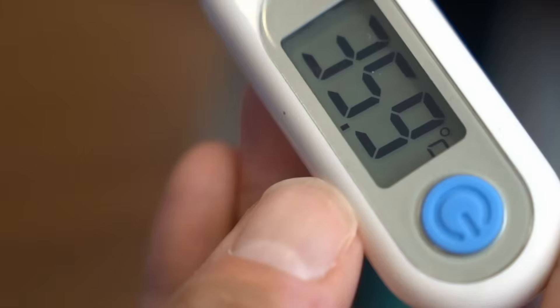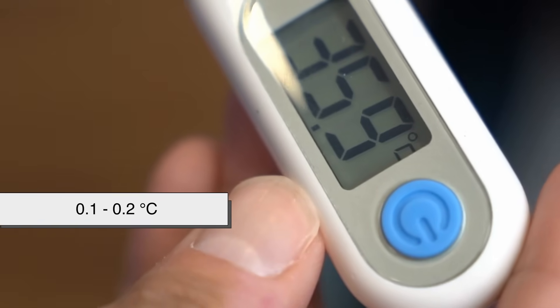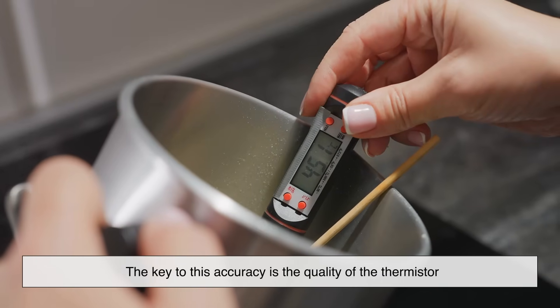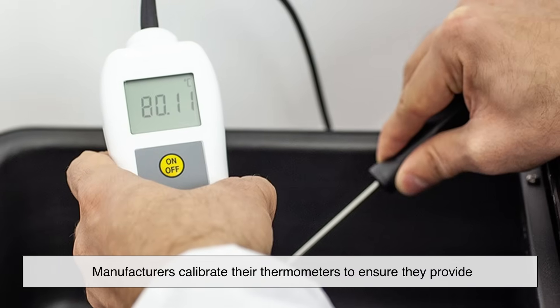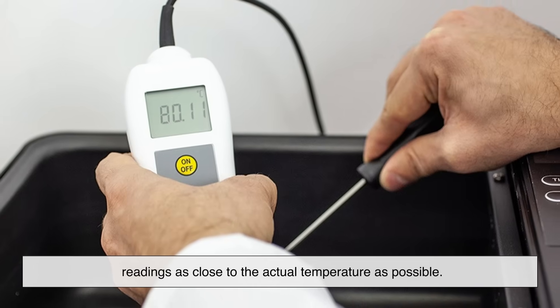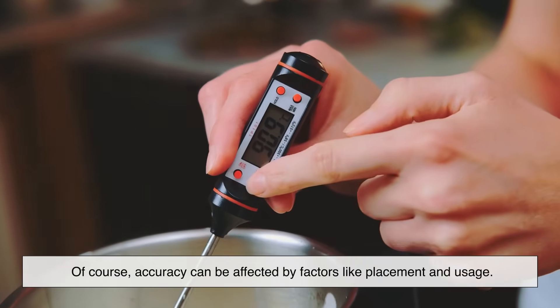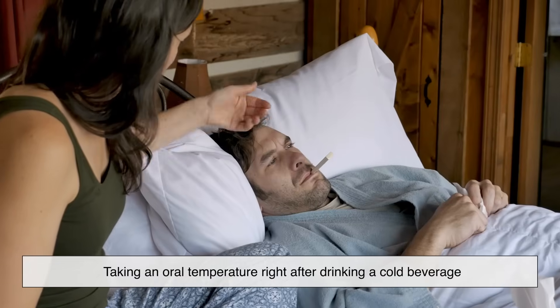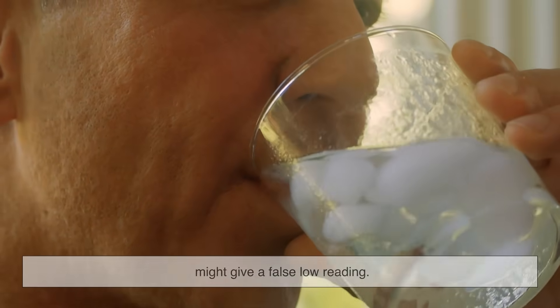You might be wondering how accurate these devices are. Most digital thermometers are highly accurate, usually within 0.1 to 0.2 degrees Celsius. The key to this accuracy is the quality of the thermistor and the calibration of the microcontroller. Manufacturers calibrate their thermometers to ensure readings are as close to the actual temperature as possible. Of course, accuracy can be affected by factors like placement and usage — for example, taking an oral temperature right after drinking a cold beverage might give a false low reading. That's why it's important to follow the instructions for proper use.